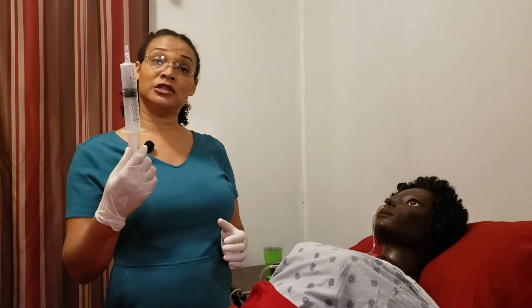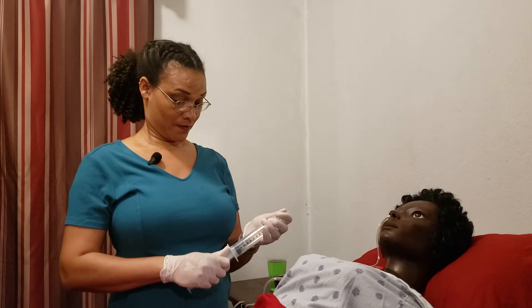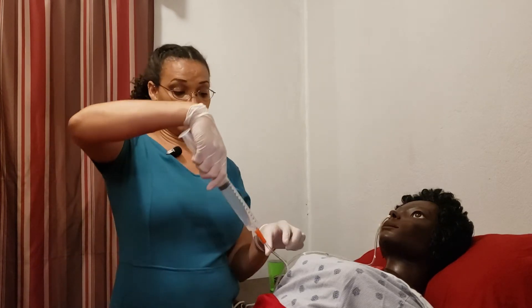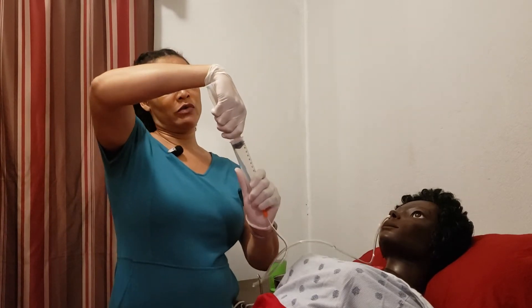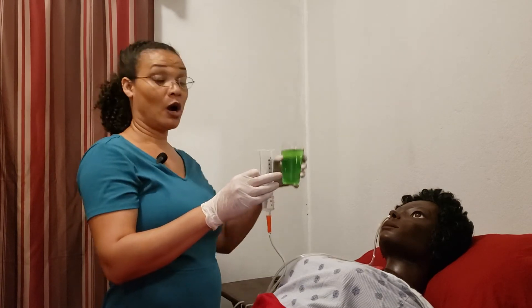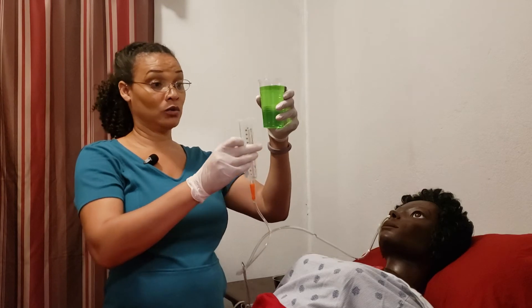This is what we consider our residual feed — the feeding we get back after the patient has already digested some of what we fed them last. We aspirate it and measure it, but the patient has to get it back. So you put the syringe on, remove the plunger while still clamped. Our feed is green just for a difference in color, no other reason.